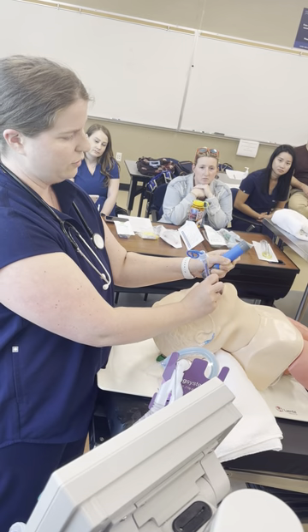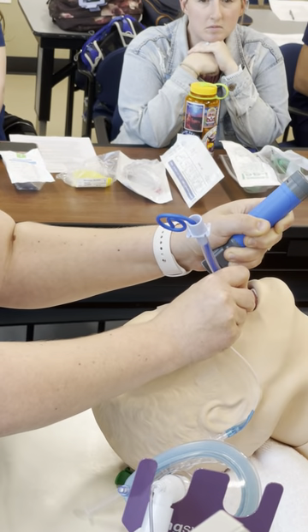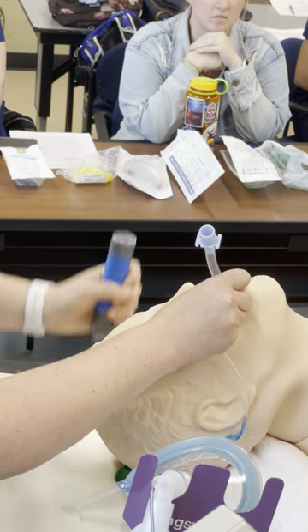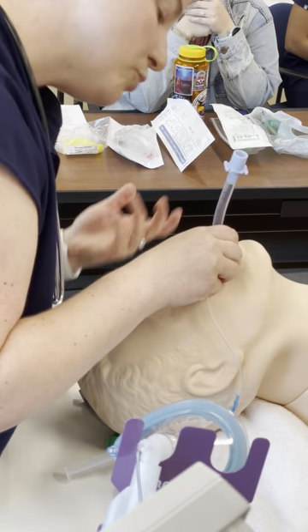I'm sliding the tube through until the balloon is past the vocal cords — pull the stylet for me, please. Now I'm looking at the depth: I'm at about 20 at the teeth.